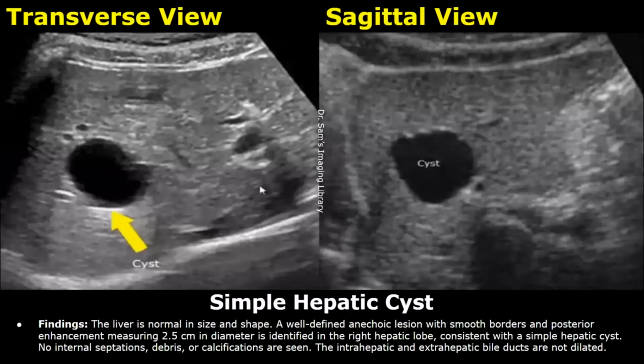We are only focusing on liver pathologies, so the findings and impressions are just related to the liver. It is not a complete abdominal ultrasound report.